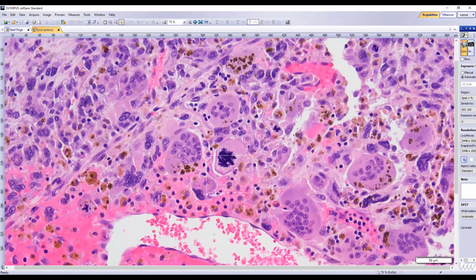And there is another type of similar cancer, just like you were mentioning, Akanksha was mentioning, the anaplastic. And that one also looks very similar, but there the giant cells are also malignant. And there, both the individual tumor cells and the giant tumor cells pick up keratin. That's how you differentiate the two. Wow. Does that make sense?